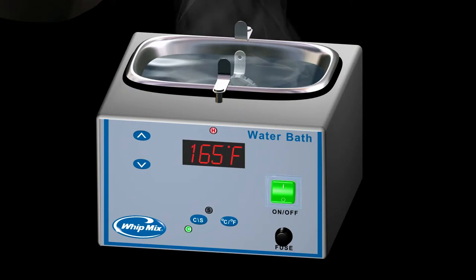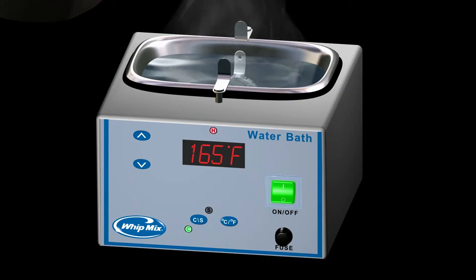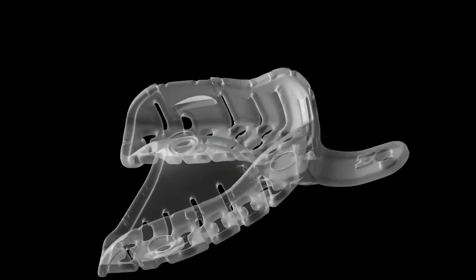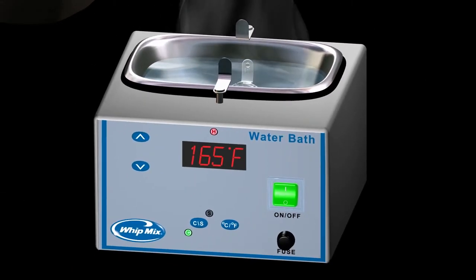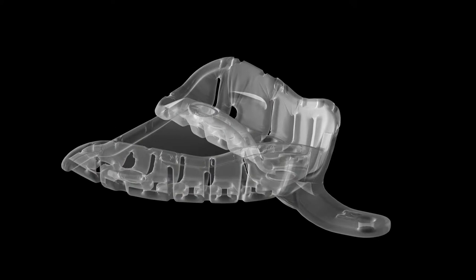Caution! Do not overheat trays. Maximum heating times are less than 40 seconds for small trays and less than 60 seconds for large trays. Do not place in the patient's mouth if the water bath temperature exceeds 165 degrees Fahrenheit or 74 degrees Celsius. Only the body of the tray should be completely immersed in the hot water bath, held by the handle slightly outside the heated water. The tray body should be immersed at 165 degrees Fahrenheit for 10 to 40 seconds, or until the tray becomes rubbery. Smaller trays will require less heating time compared to larger trays.